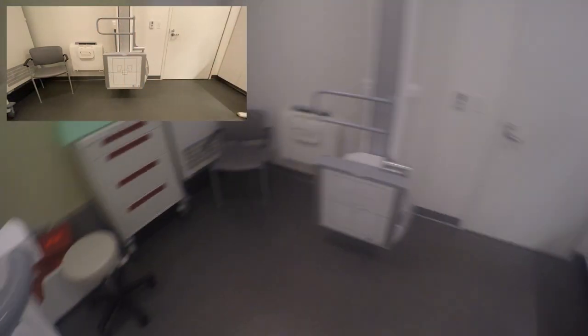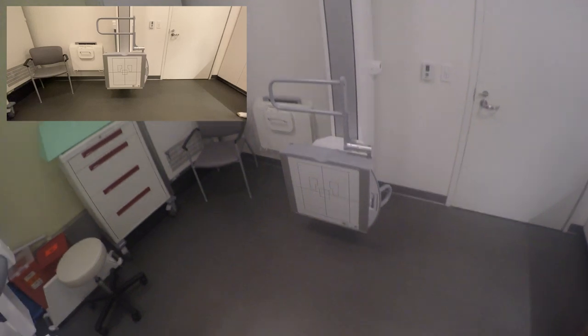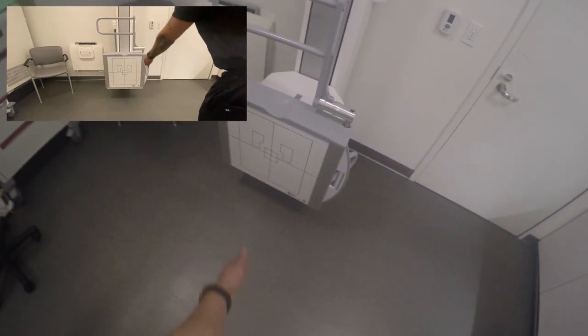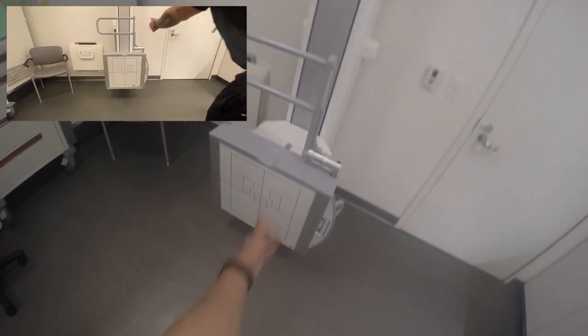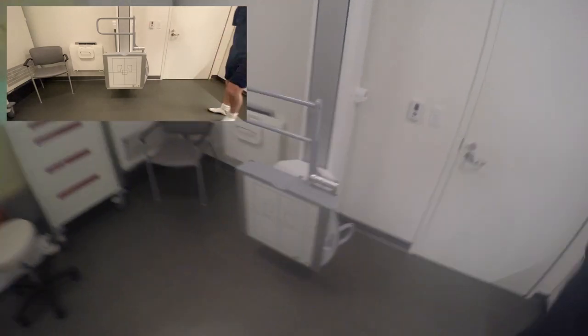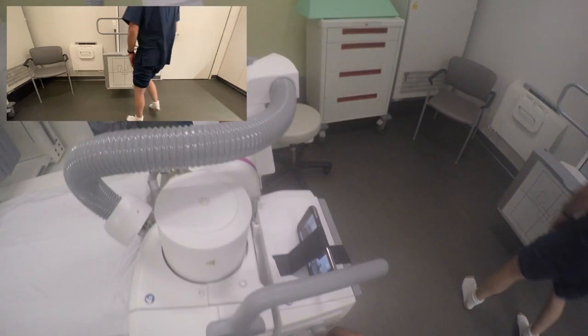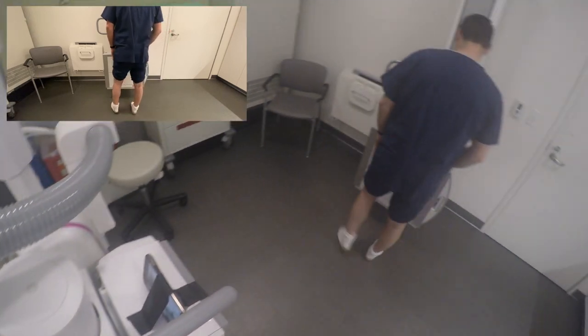Here I give a quick demonstration of what I want my patient to do. I like to show my patients a brief demo and clear instructions whenever I'm at the wall bucky so they have some idea of what they're going to do. Especially being a multiple-view exam, I find it makes it that much easier and efficient. I always keep my patients in the loop, and the feedback I get from them is always appreciative.